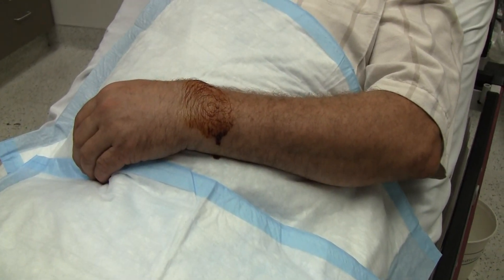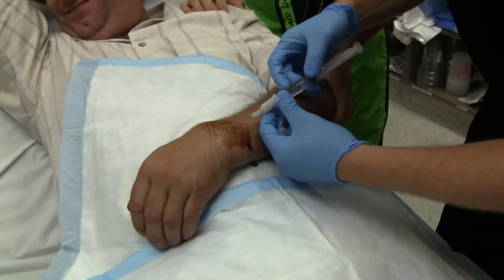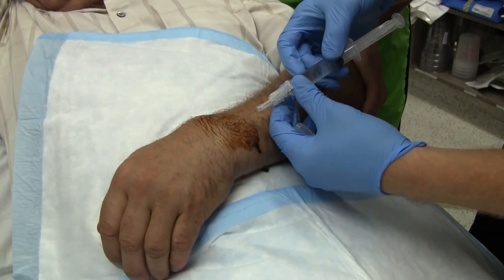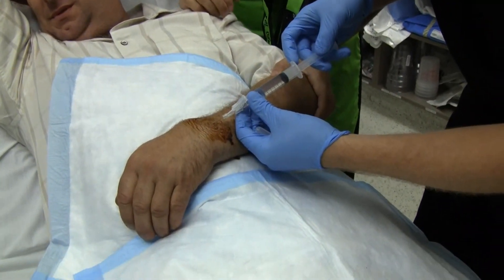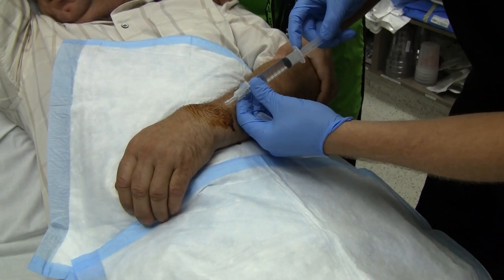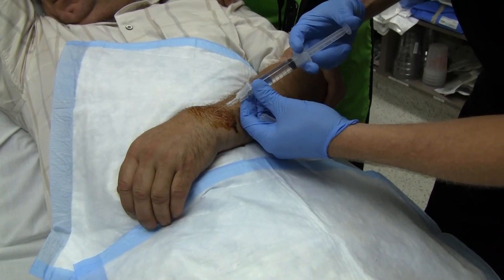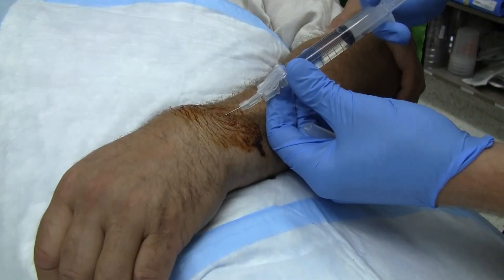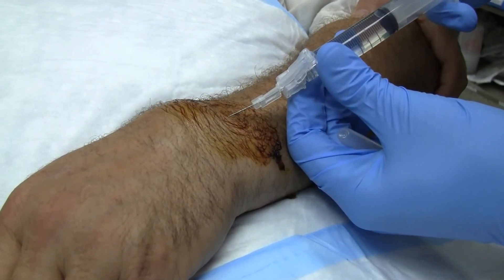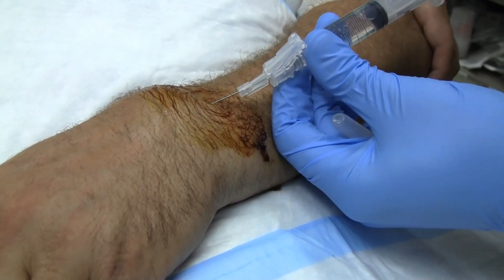They're going to be doing a hematoma block, so just tell us what you're doing while we do it. For the hematoma block, we're going to put the needle in the hematoma right at the fracture site, aspirate part of the blood out, and put some lidocaine into the hematoma. We'll go back and forth several times.